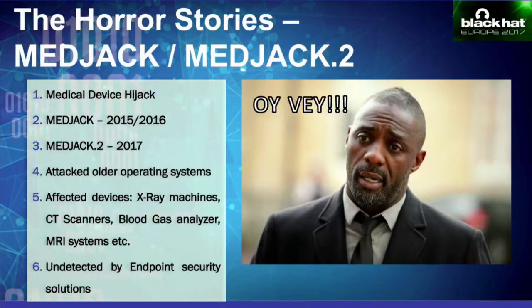It went completely undetected, and once it compromised these medical devices, it started to use them as pivot points to attack further machines on the network. I think it also utilized Citadel and Zeus malware to move laterally on the network, which goes to show that once someone is on the internal network, it becomes very easy. A lot of other opportunities open up to compromise further infrastructure and exfiltrate data.